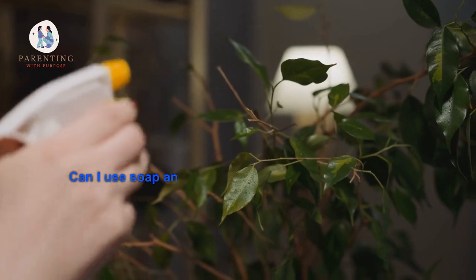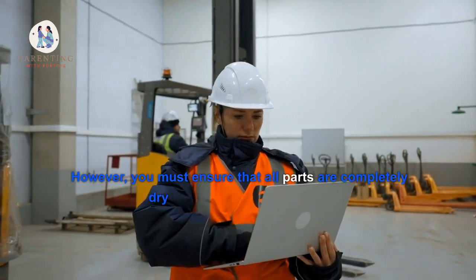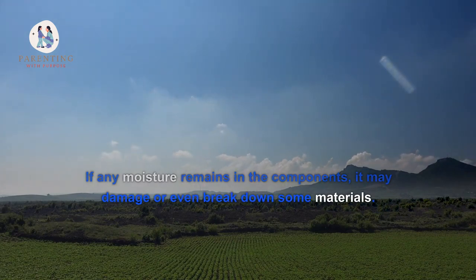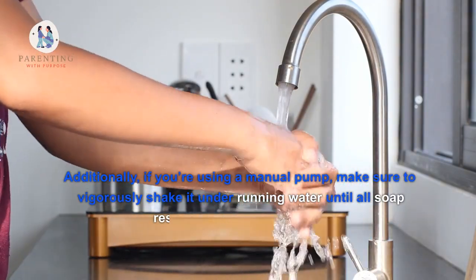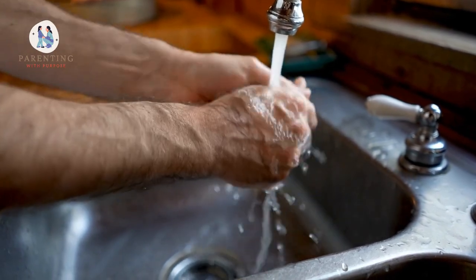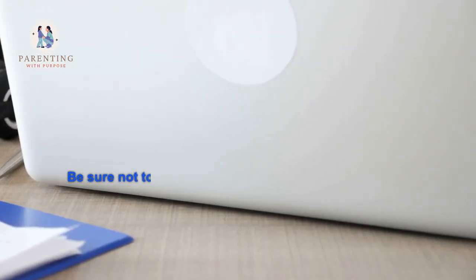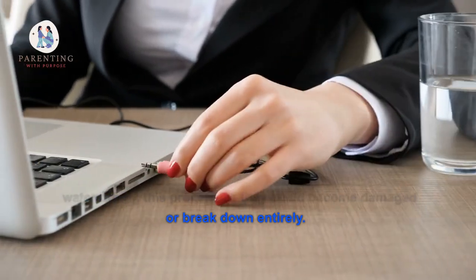3. Can I use soap and water to clean the parts of my breast pump? Yes, you can use soap and water to clean the parts of your breast pump. However, you must ensure that all parts are completely dry before using them again. If any moisture remains in the components, it may damage or even break down some materials. If you're using a manual pump, make sure to vigorously shake it under running water until all soap residue has been removed. For electric pumps, disassemble the parts and dip them in warm soapy water for about 10 minutes. Then rinse with cold water for an additional three to five minutes before air drying thoroughly on a clean towel.